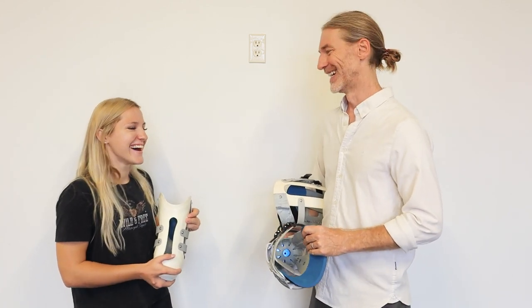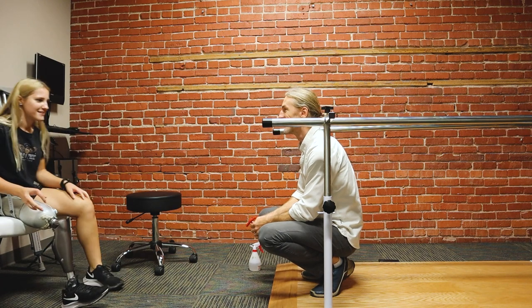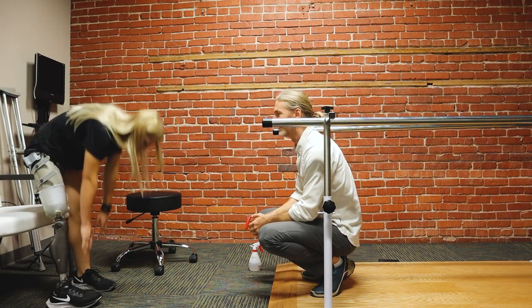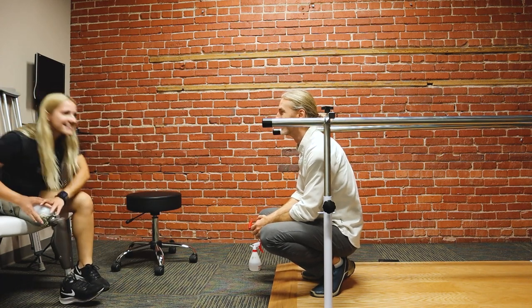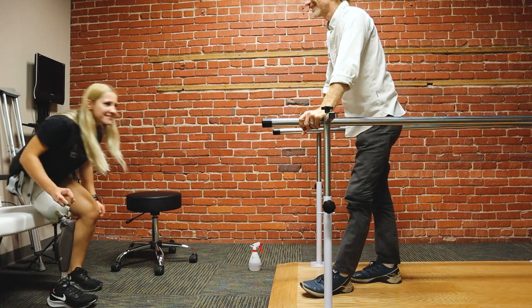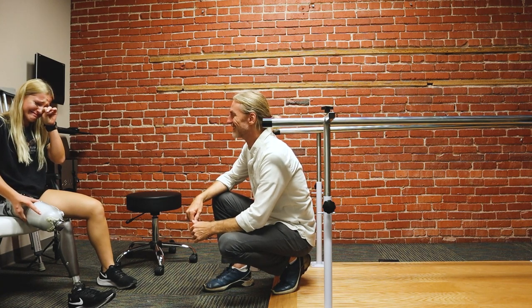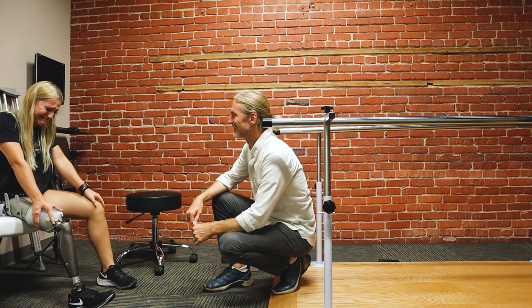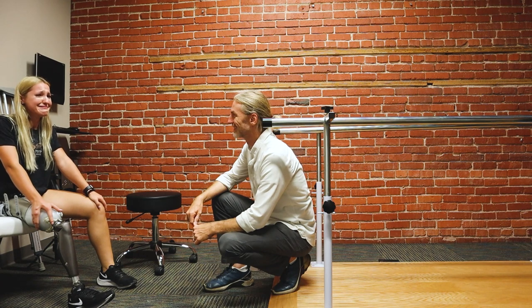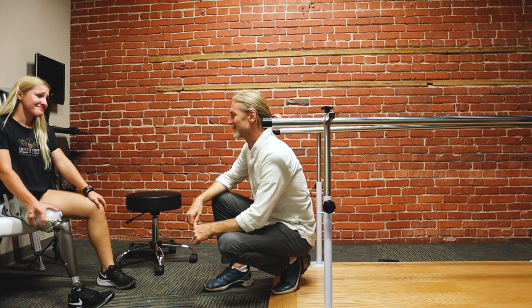Do you have more range of motion now? That's crazy. Oh my God — I'm not being blocked by it. I'm not being blocked by it. That's so weird. Game changer. Game changer.